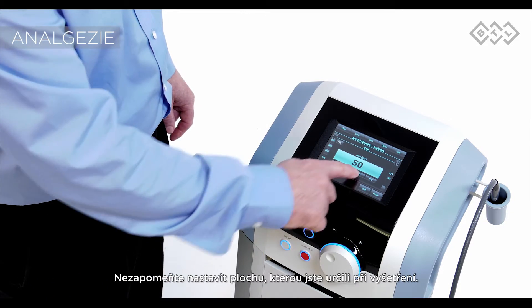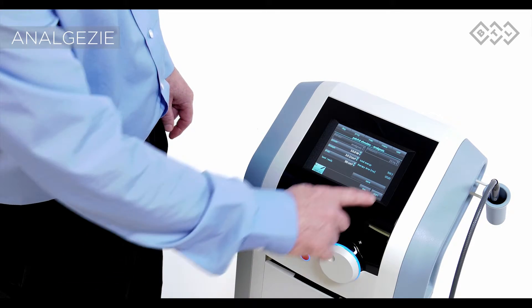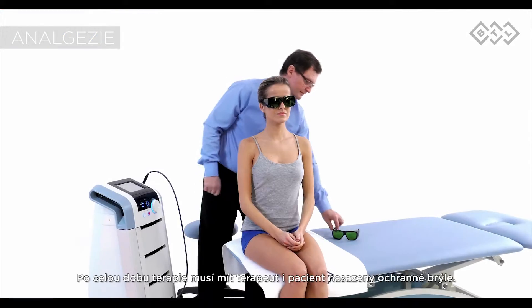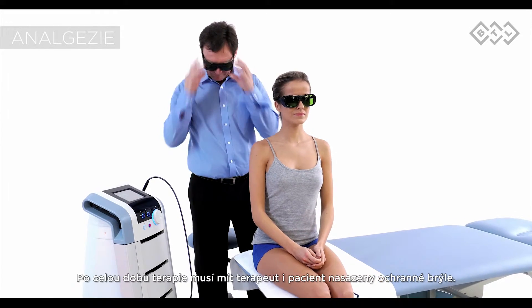Remember to adjust the area to the one estimated upon examination. Both the therapist and the patient must be wearing protective eyewear.